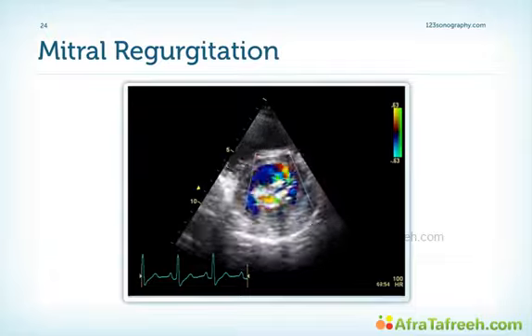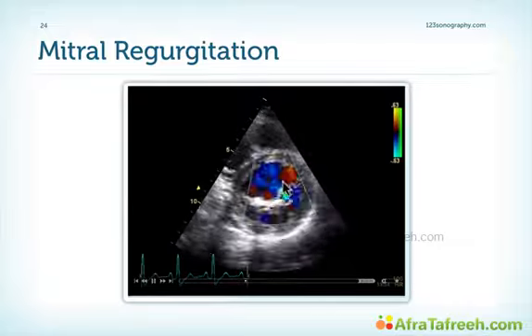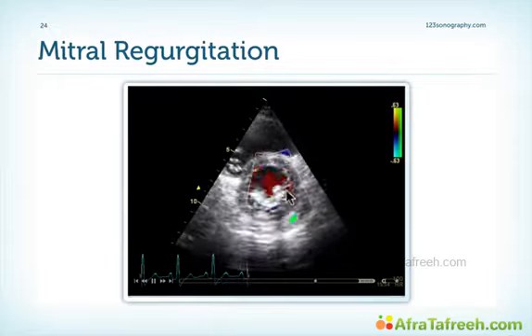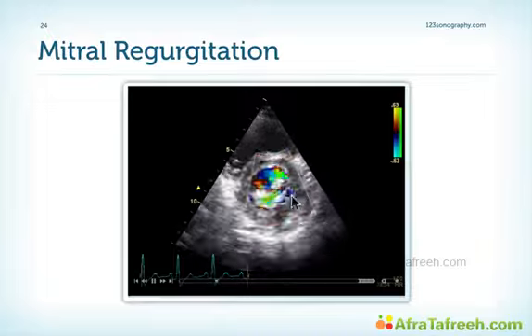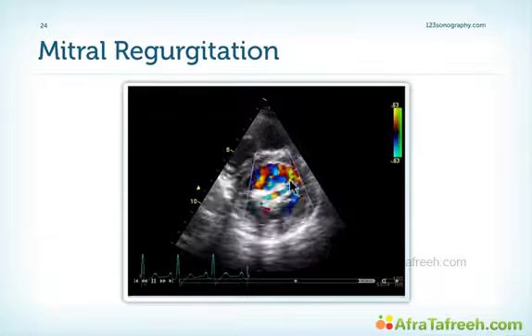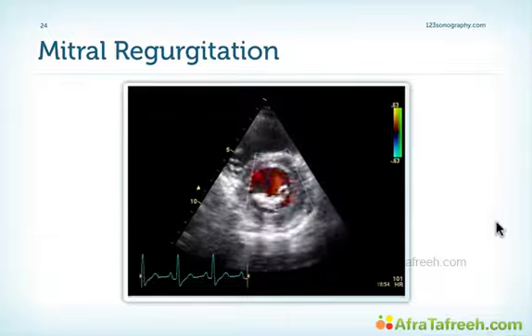To better appreciate that, we can use a short axis view, and in reality we were correct. The regurgitant lesion is right here at the commissural region. But this is basically an effect that we want to achieve because we want to rupture the commissure. So right in the region of this commissural rupture, we have the origin of the mitral regurgitant jet.